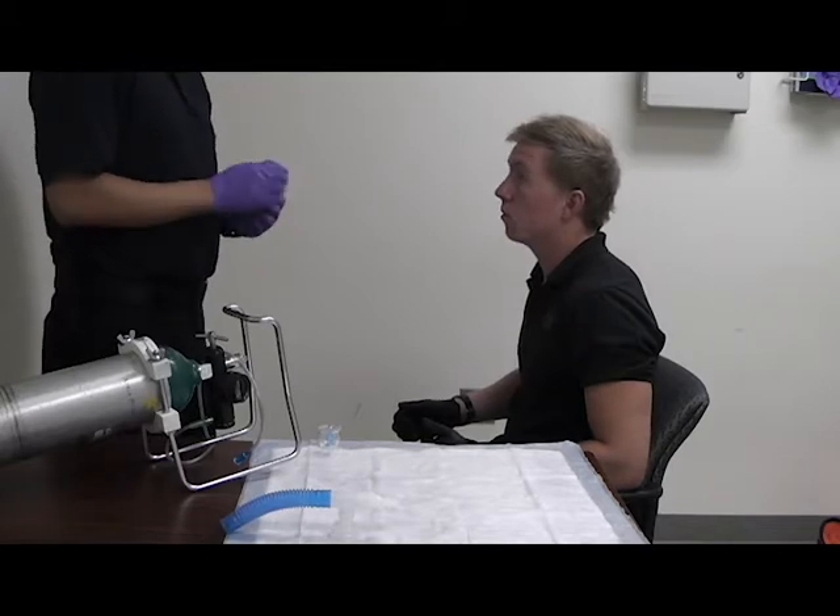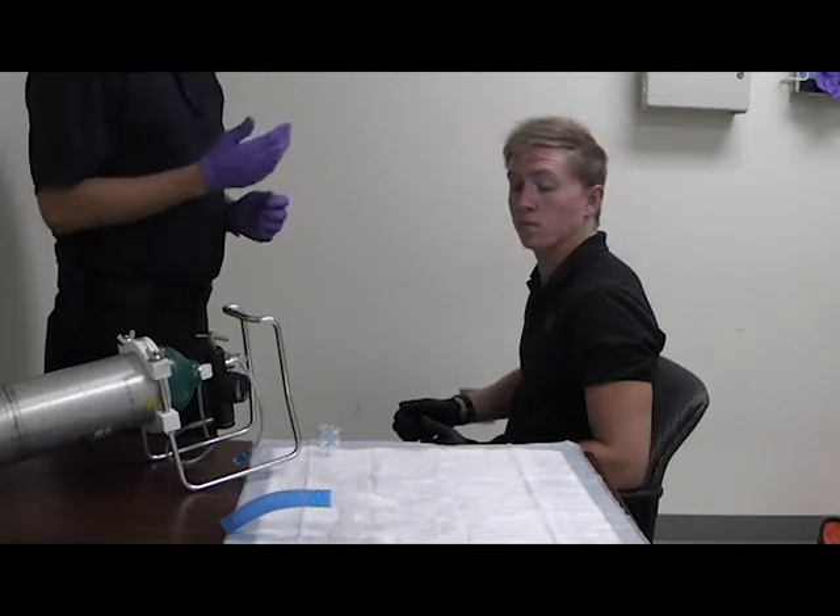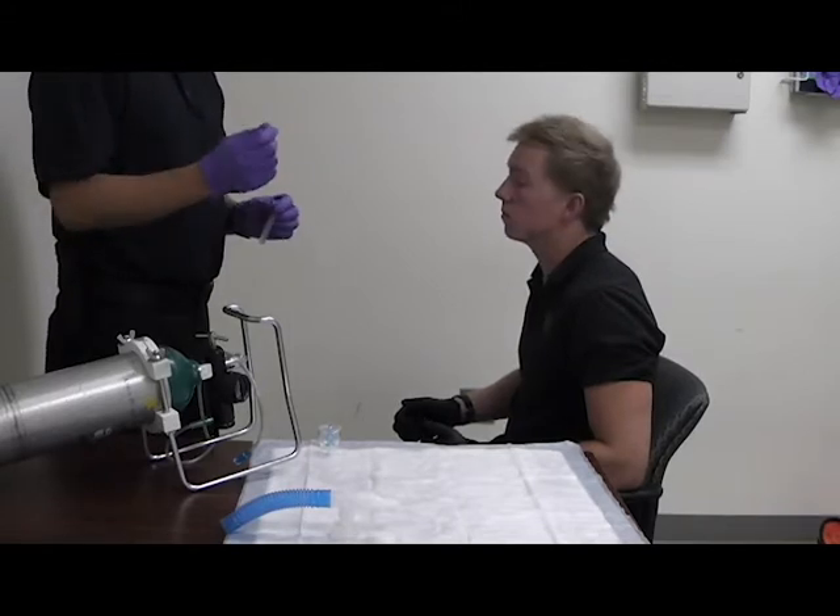Right patient — it's for my correct patient. The correct amount, it's going to be the whole vial. The correct time — it's the correct time to give it — and then we're going to write it all down at the end.